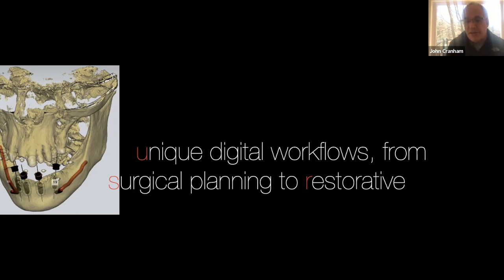And what I'm finding so far is that everybody that we've tried, when I'm checking vertical and closest speaking method, we're extremely close. So I might have to adjust things a little bit, but it's not like we're having to move the teeth around. That's what I was worried about, that this is a fixed thing, like the teeth aren't in wax. So the one case that we got lost on was one where I didn't get a good bite, and we somehow missed the bite. I don't know what happened, if we took the bite or when it was scanned, but something was off.